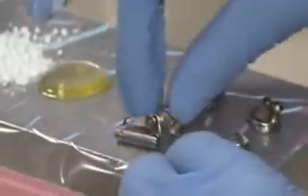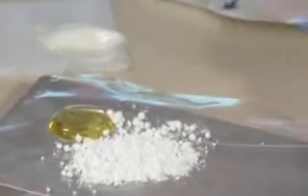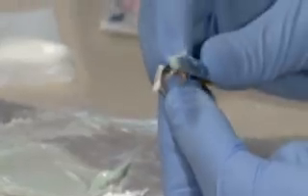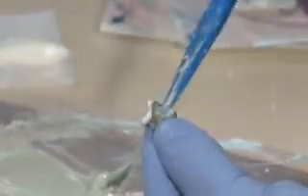Avoid getting toothpaste inside the crowns as it may contaminate the cement and weaken the bond. Mix the cement and place it in the crowns. Crowns should be one-half to two-thirds full with cement. It's best to use a cold slab when mixing the cement. A glass ionomer or dual-cure light-activated adhesive is recommended.